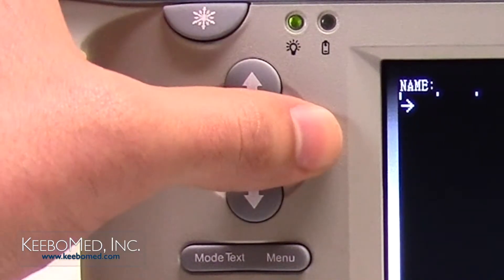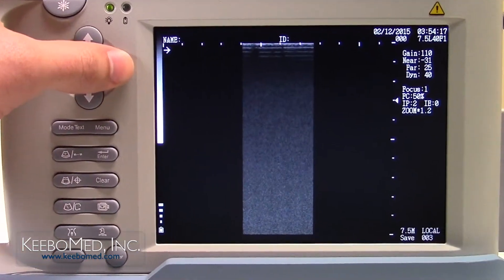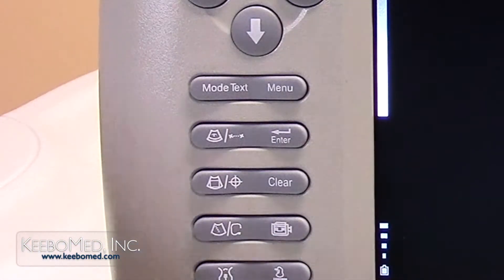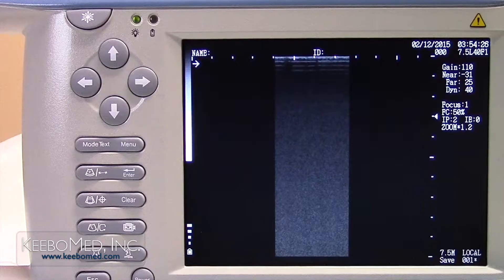Step 3. Press the direction keys to select a specific image code if needed. Step 4. Press the enter key and a wait prompt appears as the image is saved. After the prompt disappears, the current image is saved. An asterisk after the image code will indicate this.